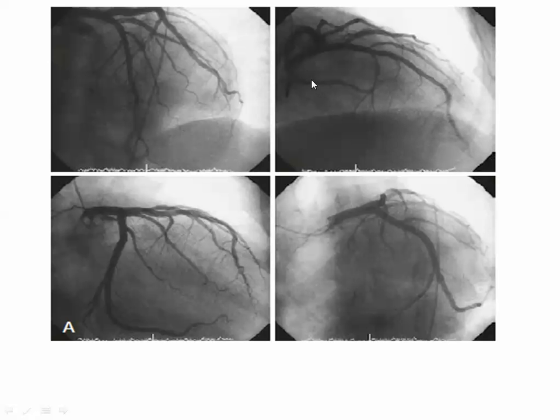This is what? This is the LCX in the AV groove. Can you see it? Okay, and not supplying the... It's not the spider. It is cranial. The spider is LAO caudal. This is RAO cranial. This is the spider view, as you asked, Dr.